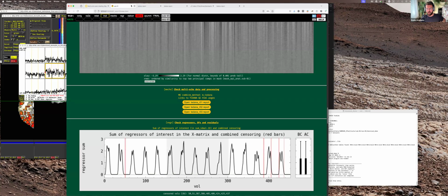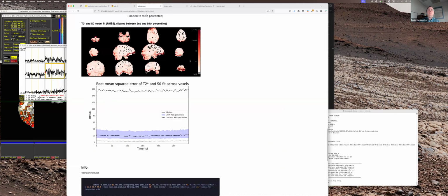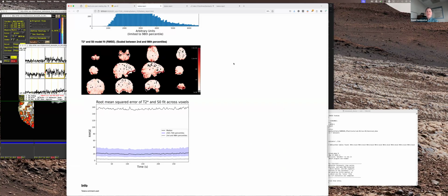You have another question now. Question, yes. From Ali. Okay. Does the, so before manual checking data post processing based on individual runs. So right now, I personally think it's good to manually check. My personal approach is, unless something is flagrantly wrong, I do not make any custom changes, because you don't want sort of like human judgment biasing your results. But if you see something clearly wrong, you can change it manually.